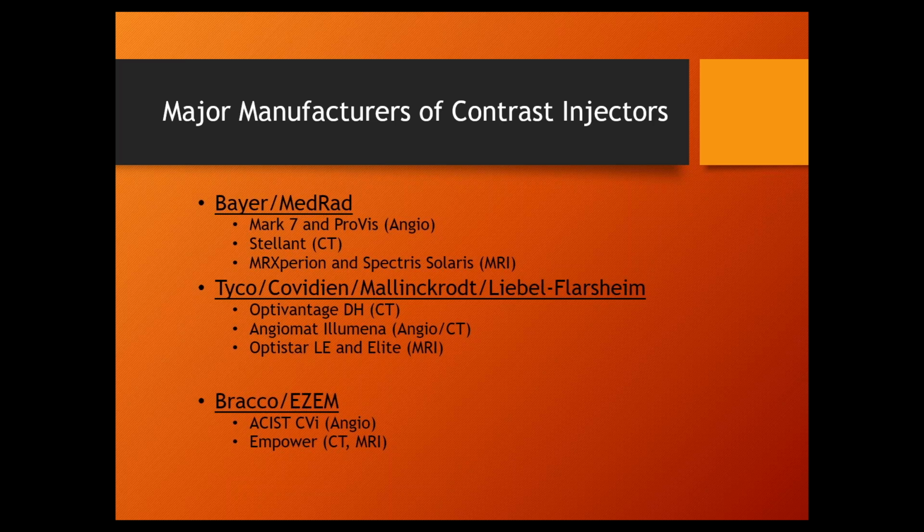All right. There is a 4th company that's really big. It's called Ulrich. Huge in Europe and Asia, but not so much here in the US, although they have started to get into the US market. They are starting to show up here. It's a crazy injector. I won't get into it, but I don't know how it works. I mean, I know how it works, but these are all piston pumps. The Ulrich injectors, if you know your biomed real well, they use peristaltic pumps, which I'm like, I don't know how you get those flow rates and consistent flow rates and volumes with peristaltic pump tubing. And if you know peristaltic pumps, you have to swap the tubing out regularly, like weekly or monthly. And the operators have to do that.